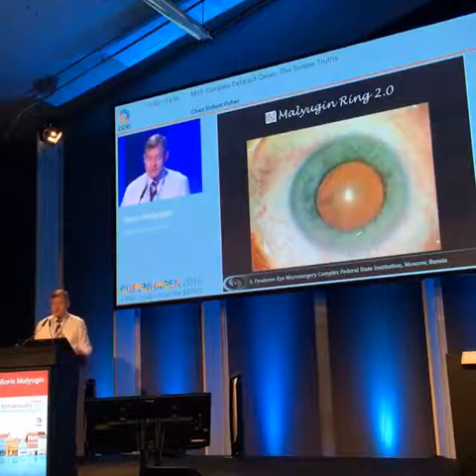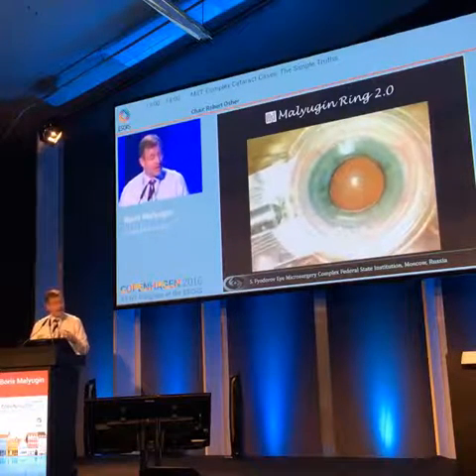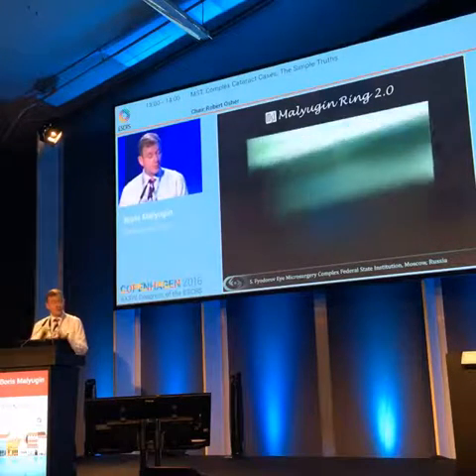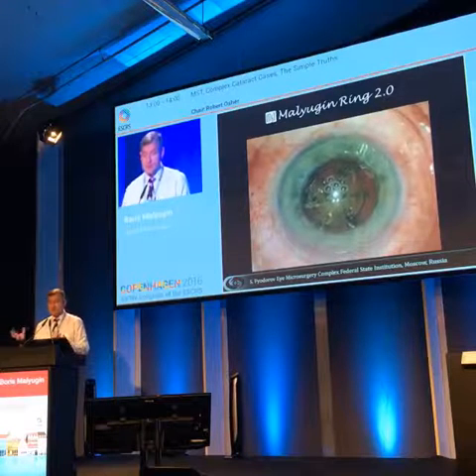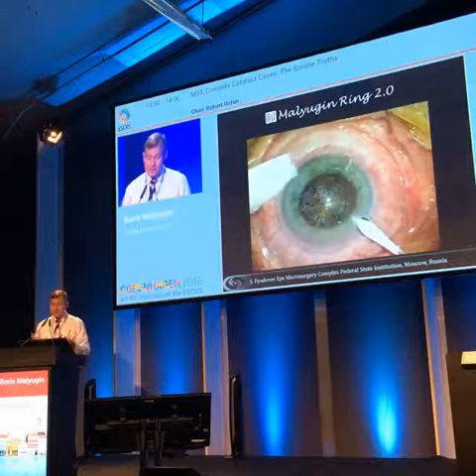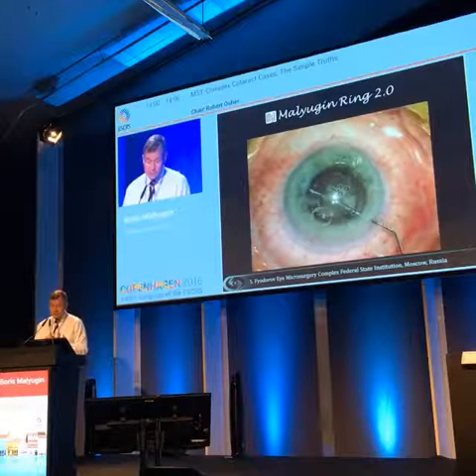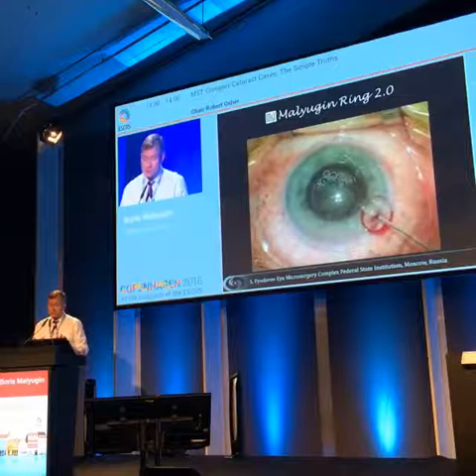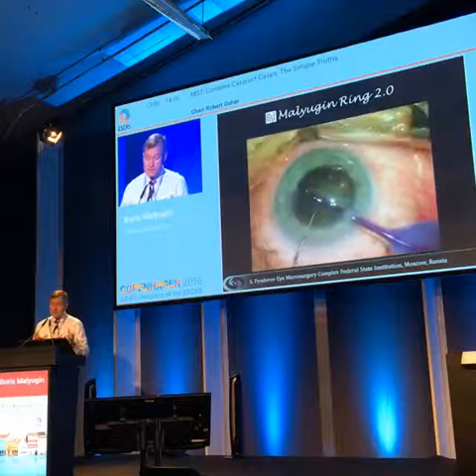So this is another laser platform. We were playing with different laser platforms. This laser platform helps you not to move your patient away to the laser step, so you can do it on your operating table. Because this is a mobile femtosecond unit, you can do everything in one step by not moving the patient, which I think is a great advantage of this step. As you can see here, the pupil was more or less okay during the femto step and during the initial steps of the procedure.